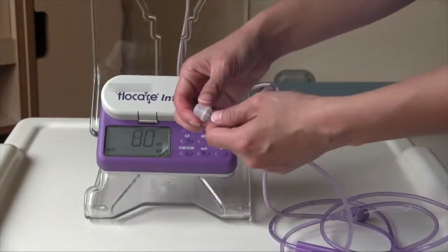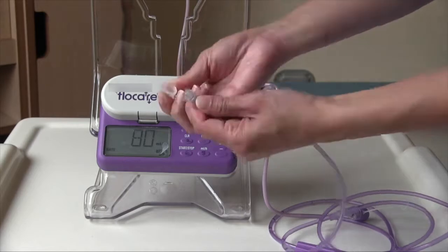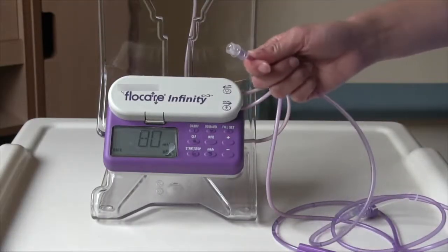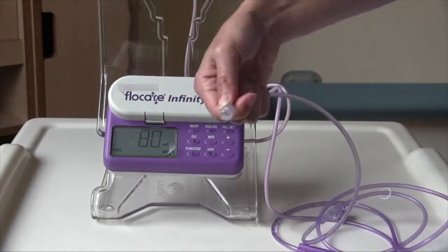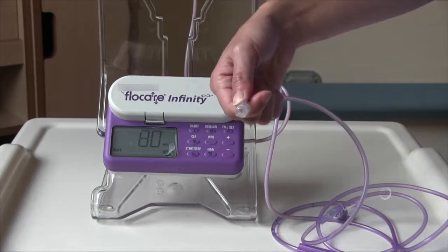To take the cap off the end of the tube, you simply squeeze, twist, and pull. Once the cap is off, you can connect the giving set to your feeding tube. To attach it, line the end of the tube to your own feeding tube port and turn to tighten, just as you have been doing with your syringes.